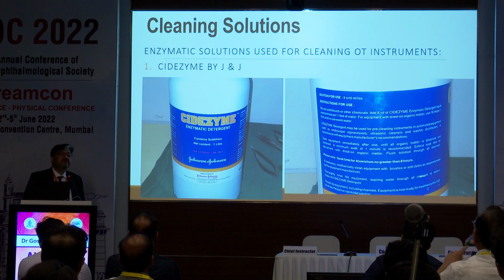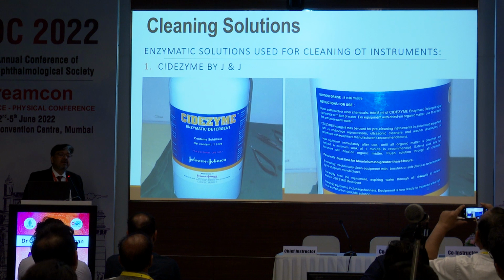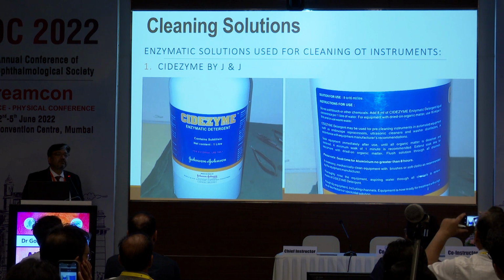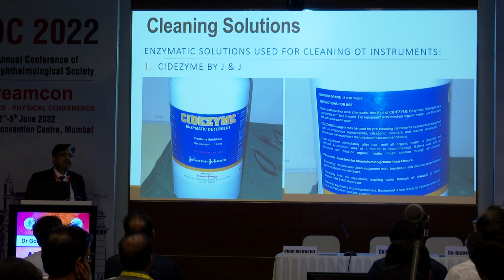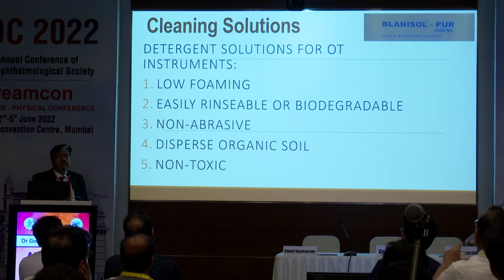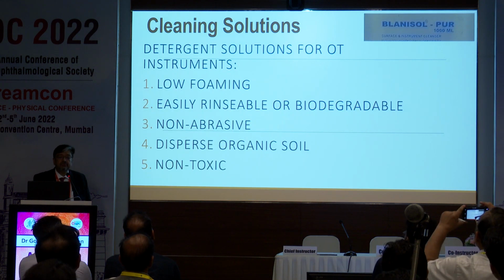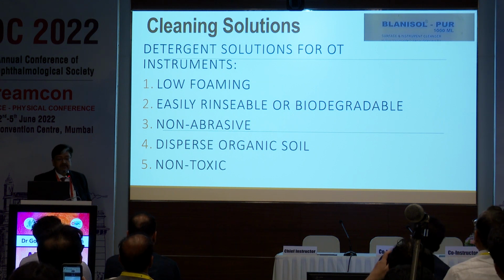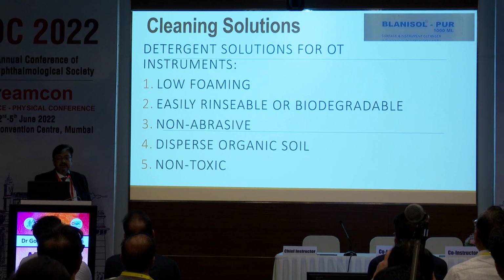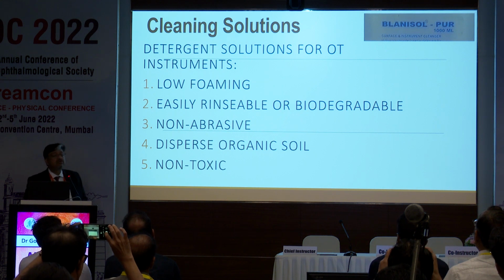And in case of, as I said, DCR surgery, you might require enzymatic removal, that is, those substances which actually break down the proteins that are left behind in the instruments and do a thorough job of cleaning. The important thing to understand is whatever solution you use, it should be low foaming, easily rinsable or biodegradable, non-abrasive, disperse organic soil, and be non-toxic.